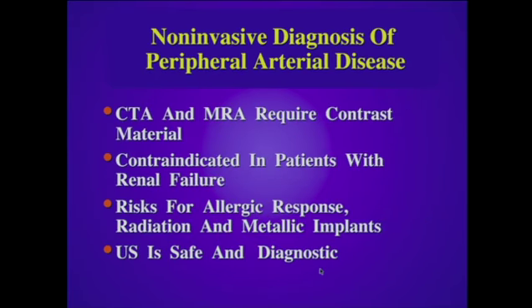Now, the non-invasive tests, including CT and MRA, have limitations in that they require contrast material, which may be contraindicated in patients with renal failure, and there are also risks for possible allergic response to contrast material, the use of radiation for CT angiography, and concern about metallic implants with MRI. Ultrasound has proven to be safe and diagnostic in the evaluation of the peripheral arteries.